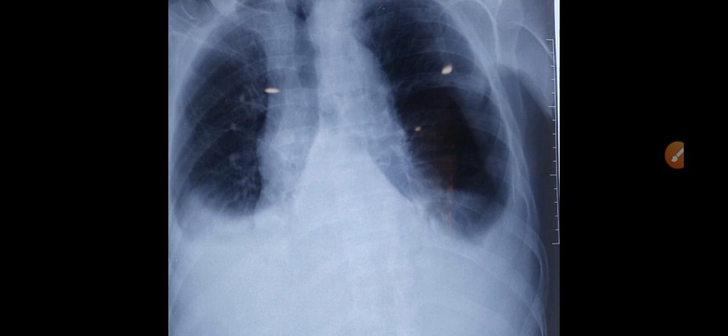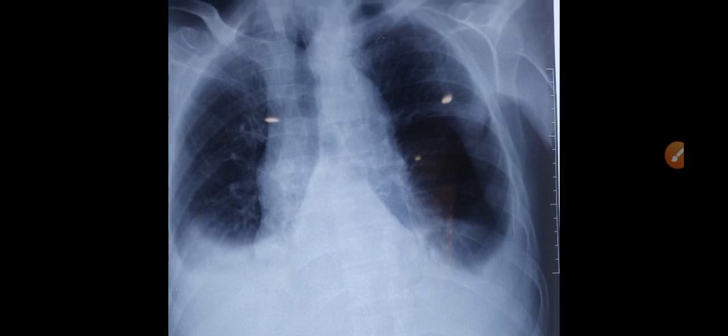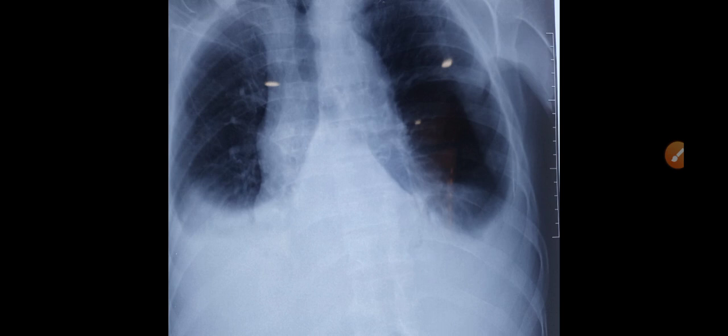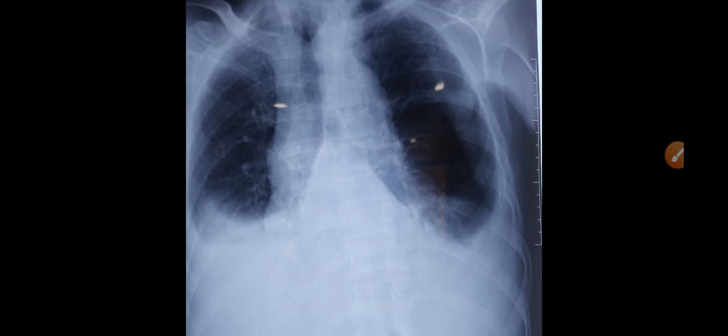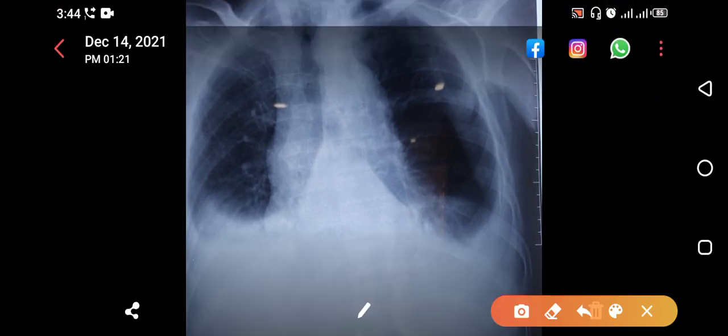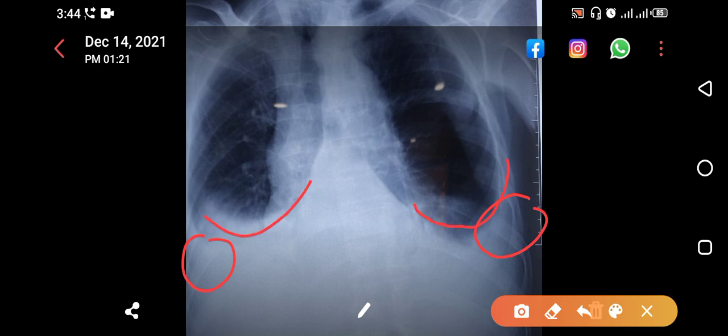When you see this type of x-ray, it is very difficult to describe. So in this x-ray, what are the obvious pathologies? Point number one: there is blunting of the costophrenic angle with a positive meniscus sign. As you can see, this is present bilaterally in this case.